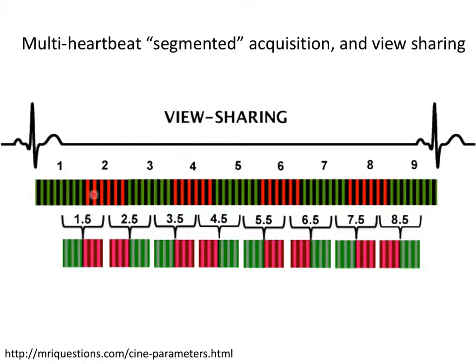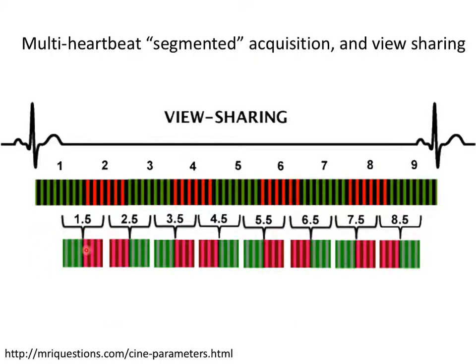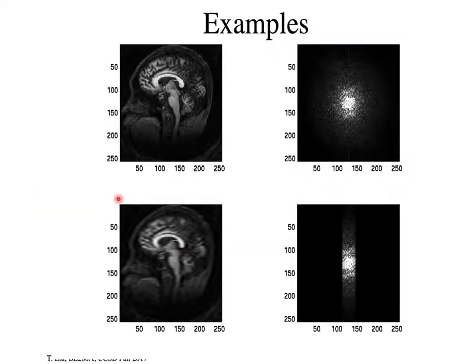We're still getting the same amount of raw data, but we're just shifting along and resampling this set of acquisitions. That's called view sharing. Obviously, these frames are not independent from these frames, so it's not a true increase in resolution. You're not going to see an independent event. It's basically one way of interpolating your data across time. It's often done, and it's called view sharing.